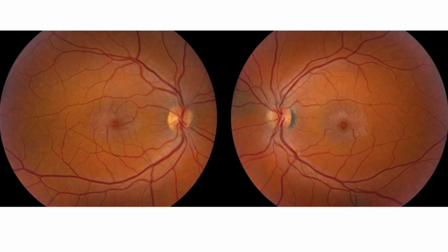So, not so recently, but a couple years back, I had a 40-ish-year-old gentleman who came in with what looked clinically like bilateral macular holes. And it was very strange because, as we know, someone in their 40s certainly shouldn't be presenting with that. Did it look like that on the fundus imaging or the posterior pole evaluation or both? Yeah, so with 90, and then we also took some fundus images, and it certainly looked like the patient had macular holes. So I said to the student, let's go get OCT. Of course, that's what I always do whenever I'm second guessing my diagnosis. It just didn't make sense.